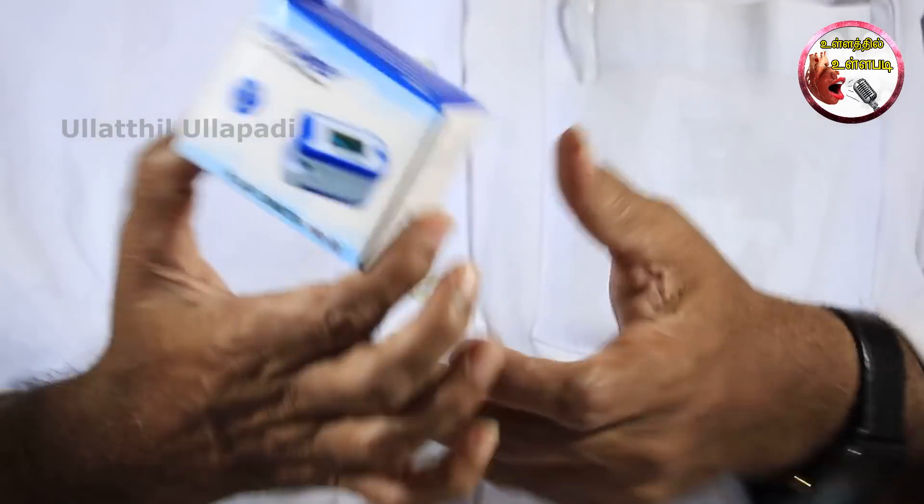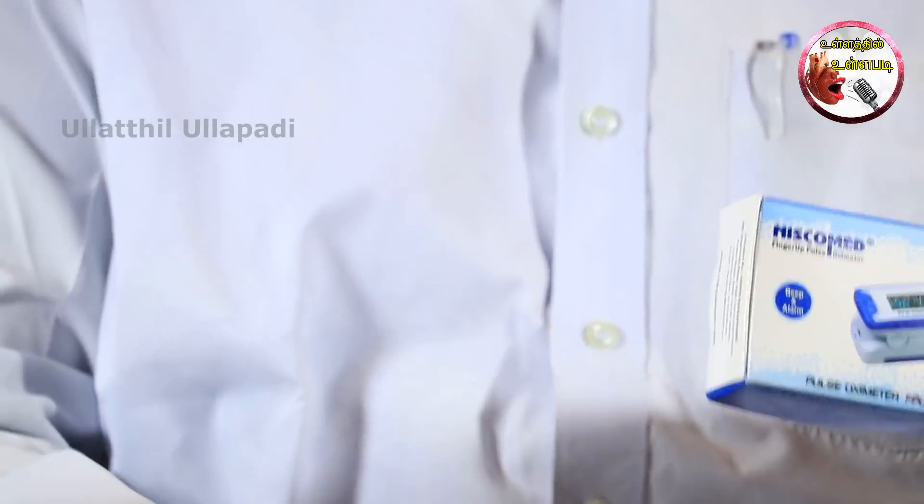We will talk about the finger-tip pulse oximeter. This finger-tip pulse oximeter works the same way. We will talk about it and share our numbers. What is the point of the pulse oximeter? What is the point of the pulse rate?